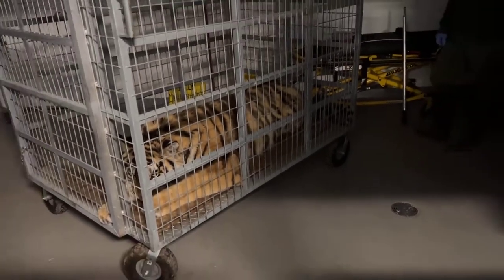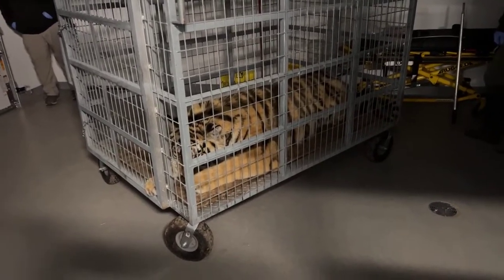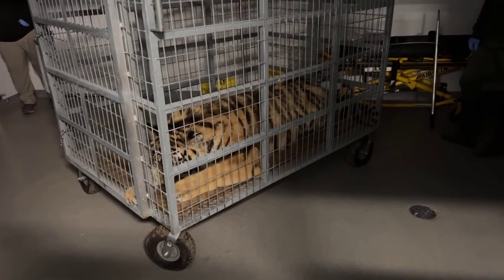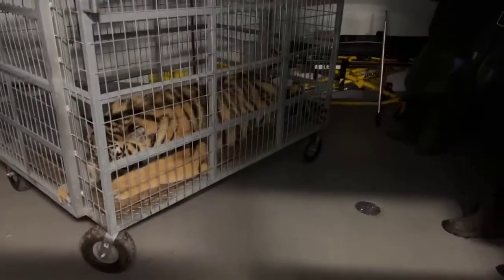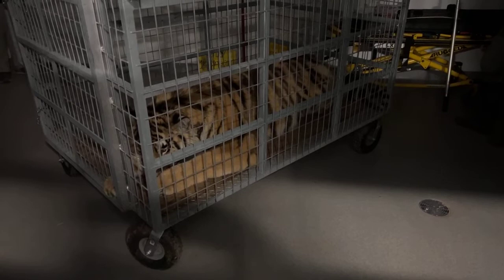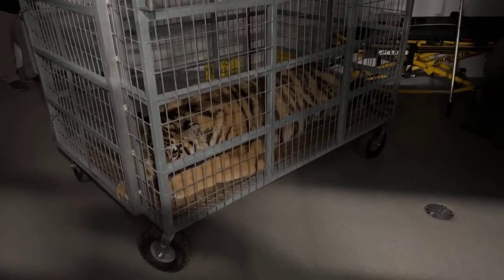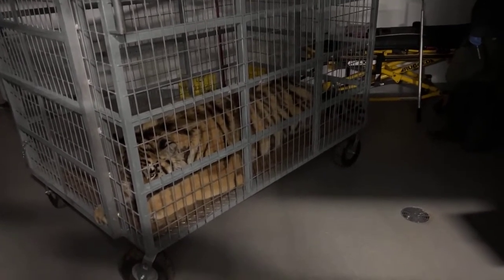And so if you're just joining us, we're taking you through Dash going to sleep. He was given an IM, intramuscular injection. And usually what we can see with the cocktail we use is that within 6 minutes we start seeing signs of the drug taking effect, and usually within 10 minutes we will see them fully asleep. Obviously our staff will test him by taking something and poking his ear, touching his ear to see if we get an ear flick or any stimulation.